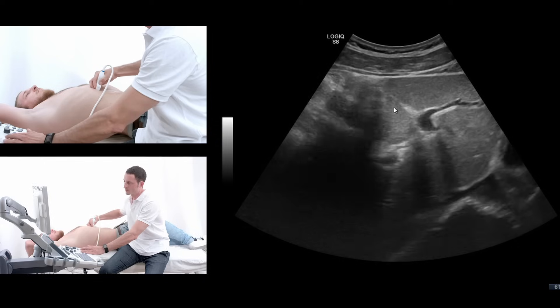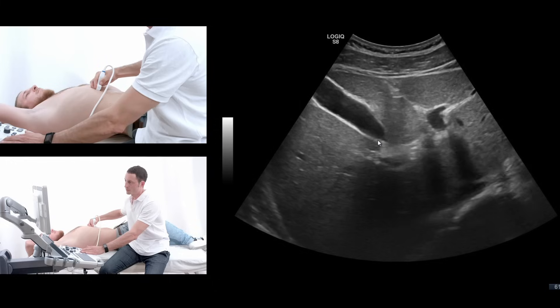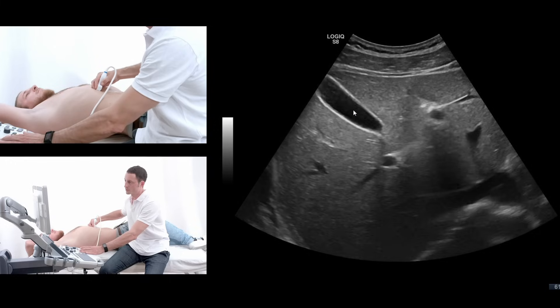Take a deep breath again. When you follow the tail of the jumping stag sign, as you can see here, you will find the gallbladder, which is here.